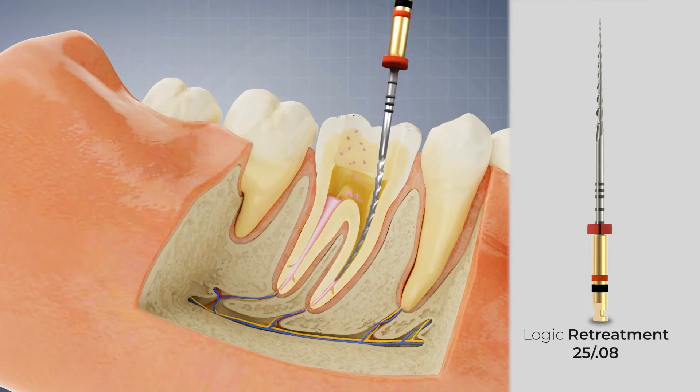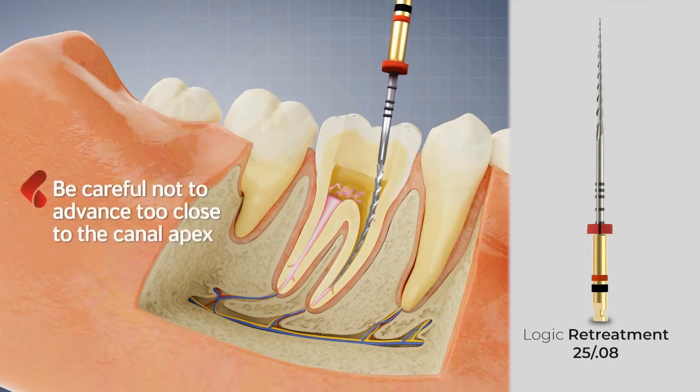Next, use the 2508 with the same procedure without advancing too close to the canal apex.